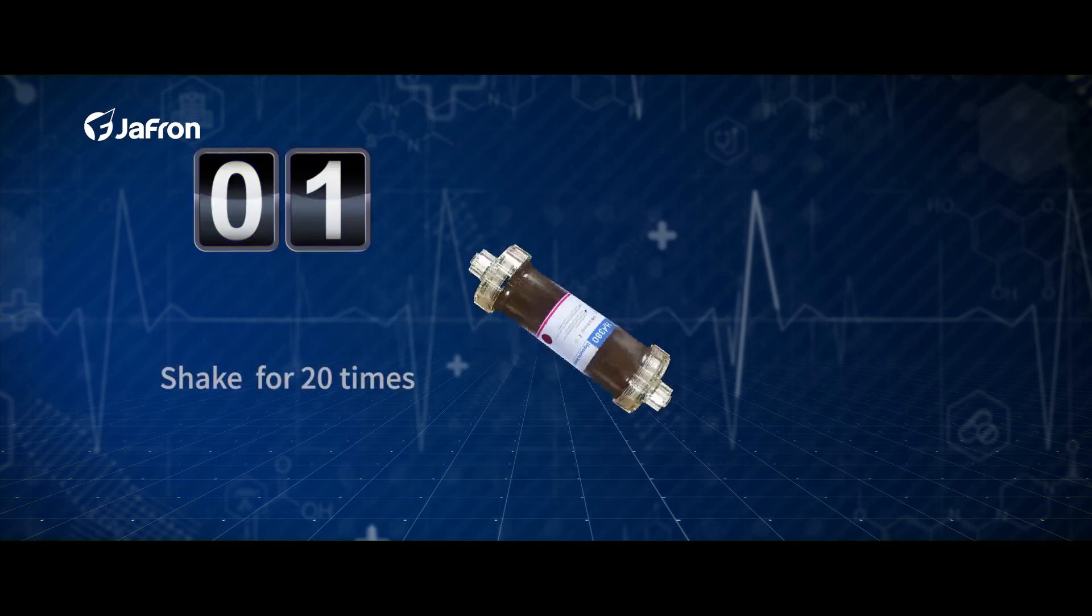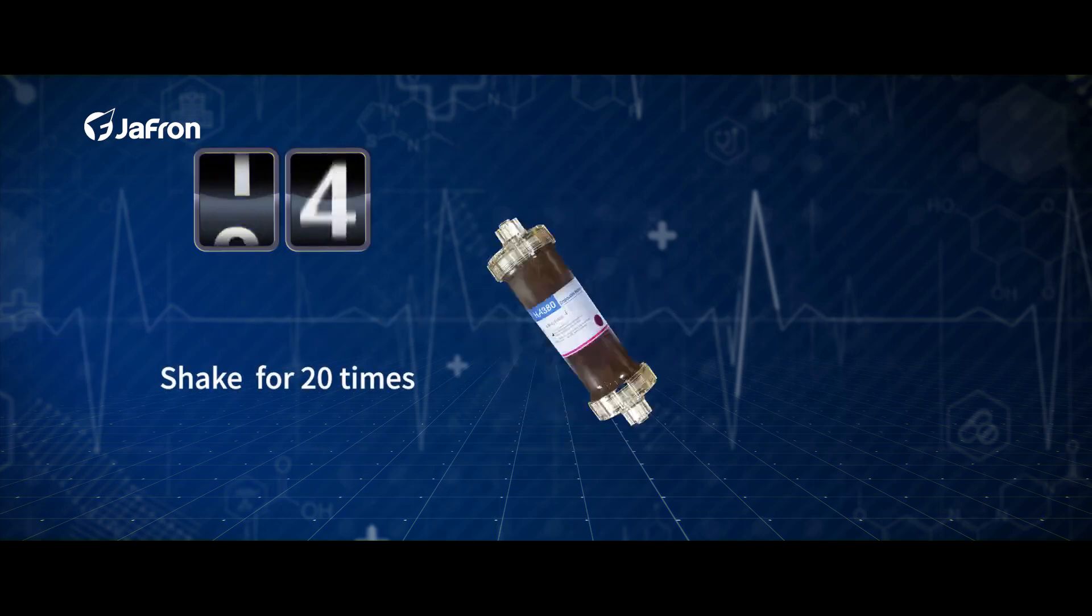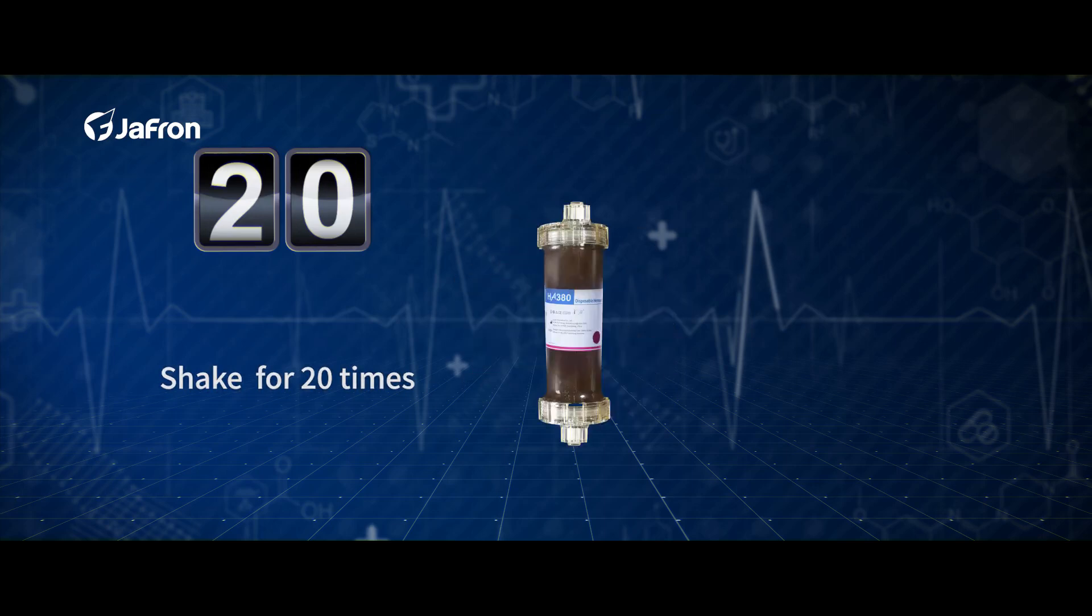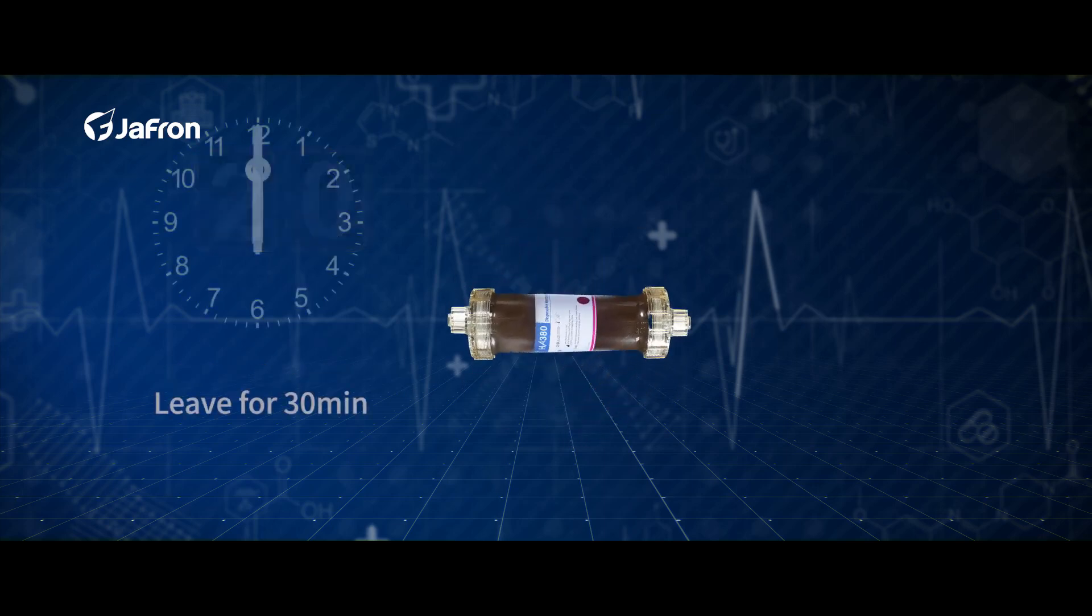Tighten the cap back to the cartridge. Shake and rotate the cartridge slightly for 20 times. Leave the cartridge for 30 minutes statically.